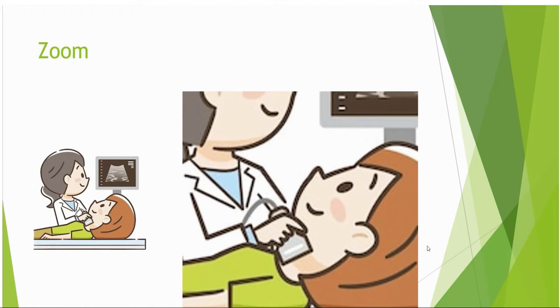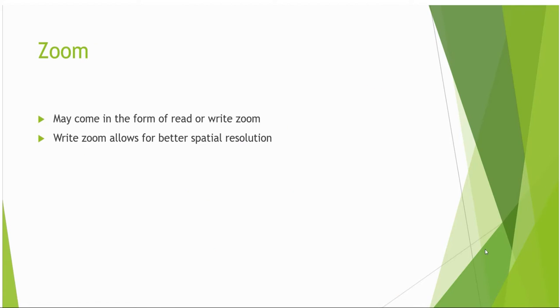Applying a read zoom is like pinching and pulling a tablet screen. The object appears larger, but the resolution stays the same. If done to a significant extent, you may notice the image or text become pixelated, as we see in this example here. Read zoom is of benefit when trying to show a reading physician a structure of interest. It makes the structure appear larger and removes areas around the zoom box which may distract the eye.